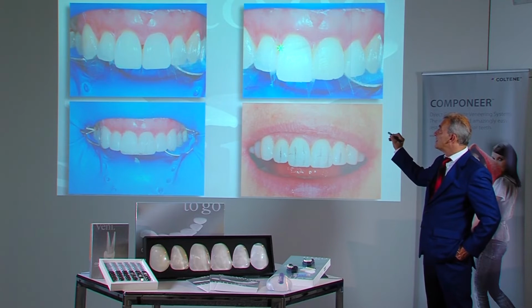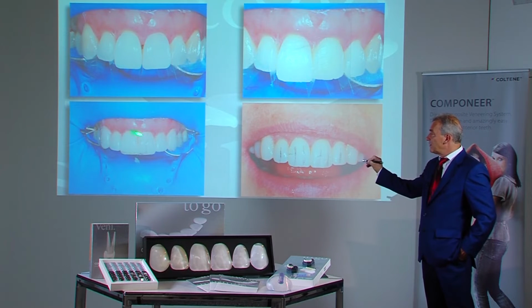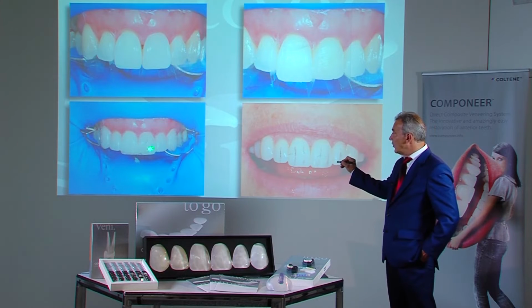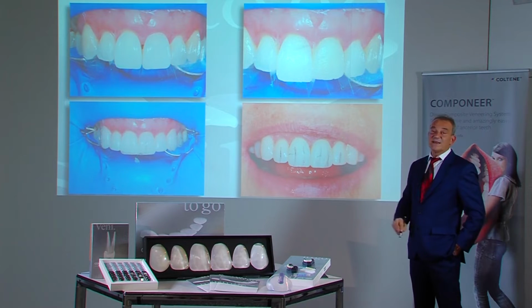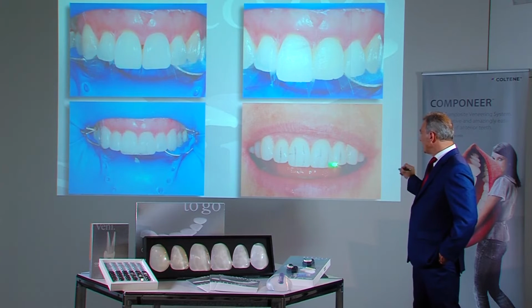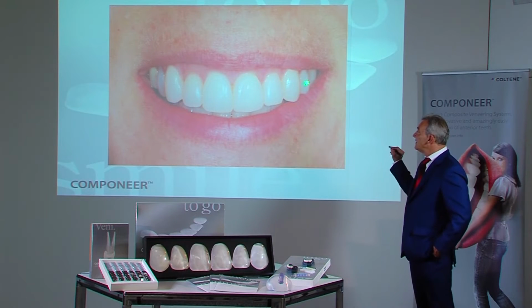The Componeers are now placed. The teeth were only roughened, etched and bonded. The fine corrections are performed at the end. The premolars are reduced slightly buccally to make the alignment between the 3 and the molar harmonious. One can see there is a premolar missing. The axial angles and the length of the central incisors can be marked again. We shorten and modify the contour a bit to give the teeth their corresponding position in the mouth.